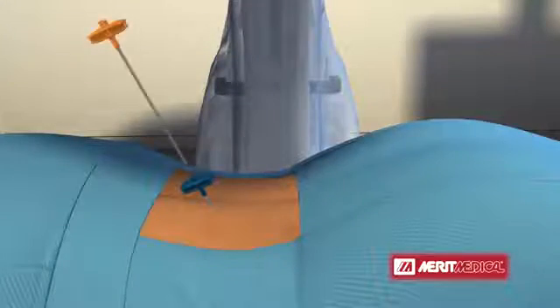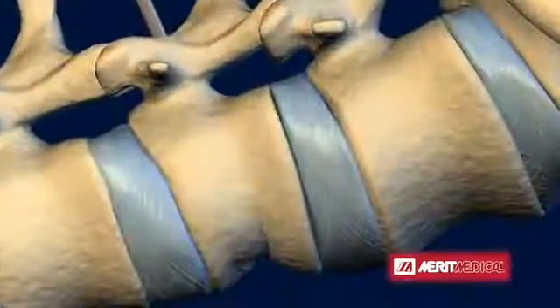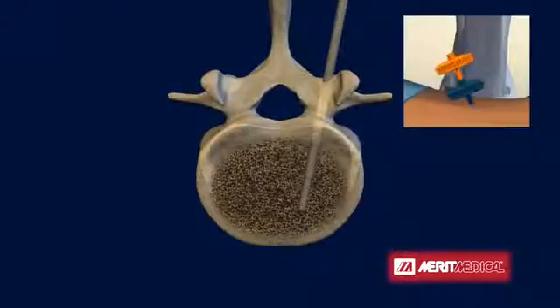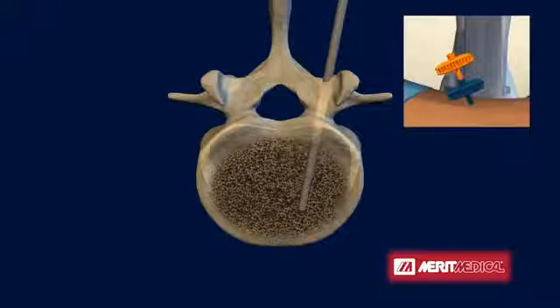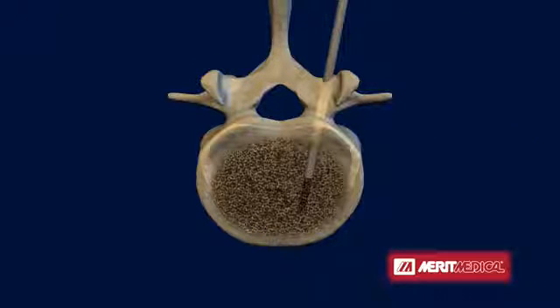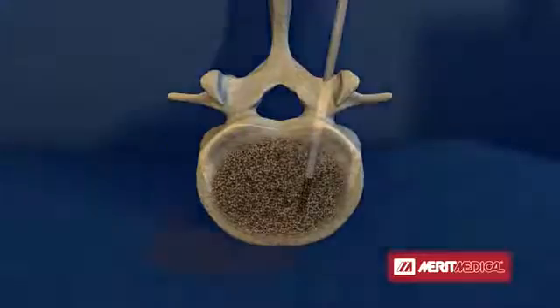The straight-line osteotome is then inserted through the introducer into the anterior one-third of the vertebral body to create an initial cavity. The osteotome may also be used to collect a biopsy specimen.